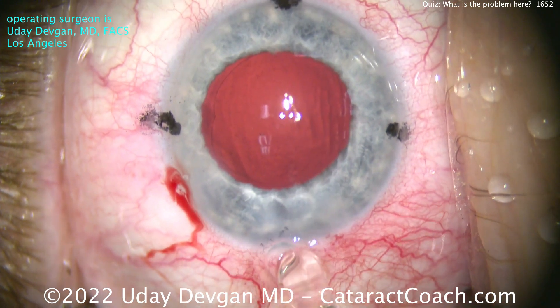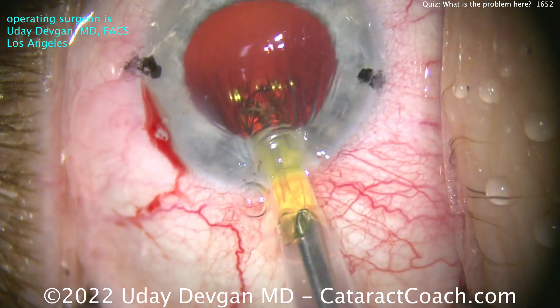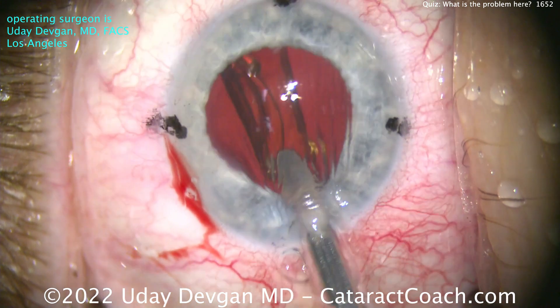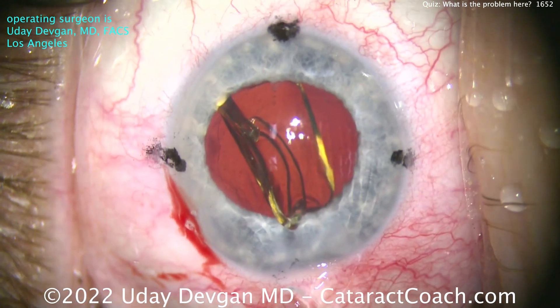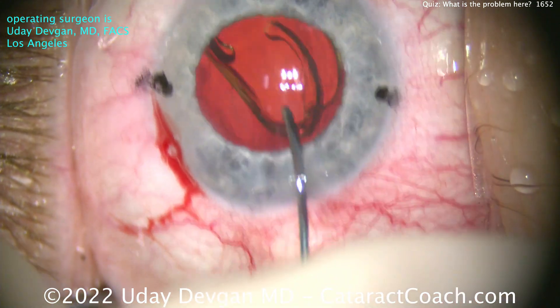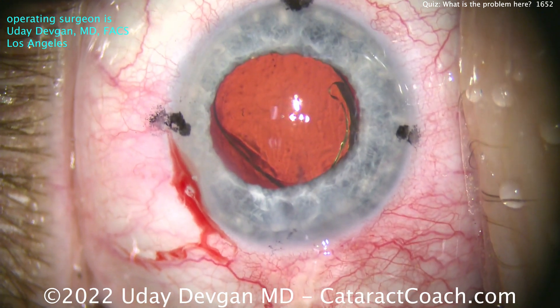Let's get the lens in — a single-piece acrylic monofocal toric lens being implanted here. Let's deliver it nice and easy, going into the eye. All still looks pretty good, correct orientation, it's not upside down. Let's get that into the capsular bag — you can see the toric marks on the eye. Using the spatula at the haptic-optic junction, getting that in, and then having that arm open up.